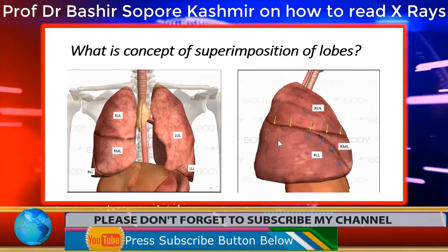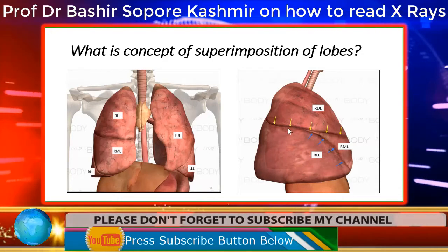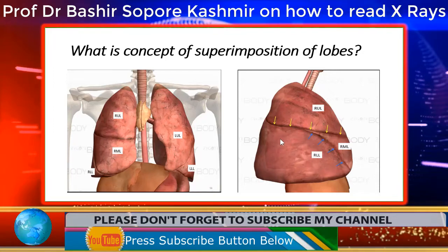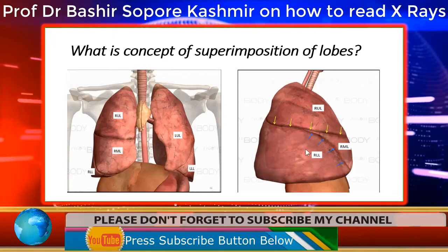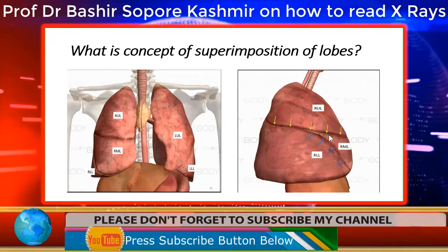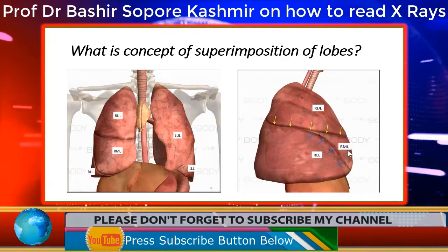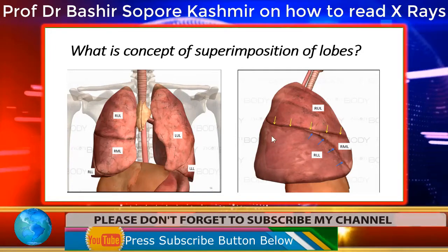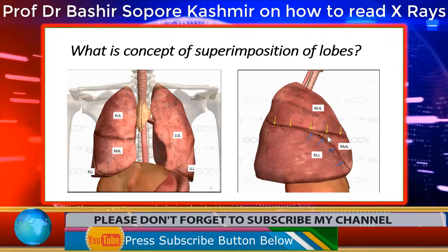and if there is any consolidation, collapse, or any tumor, whatever may be the cause, it will show as a white opacity on the x-ray. Now suppose only the lower lobe is involved, then when we see the x-ray, we will see that the middle lobe also will not be seen. It will also appear to be white. Why? Because this white portion, or this consolidation, or this opacity will overlap this portion, this right middle lobe.